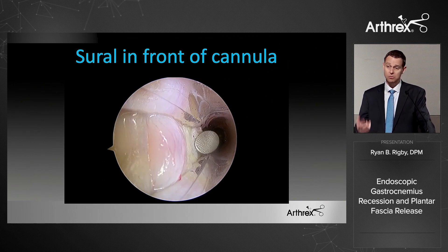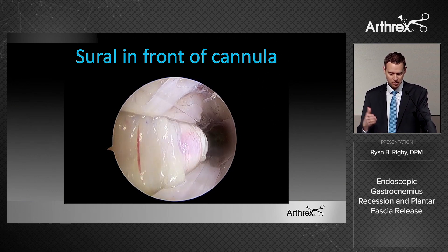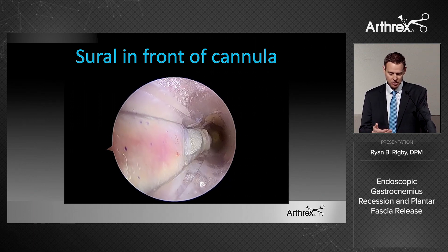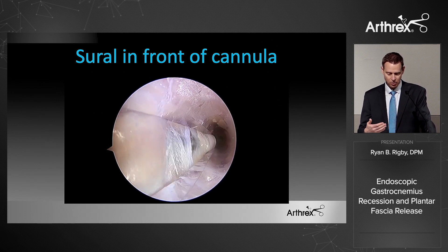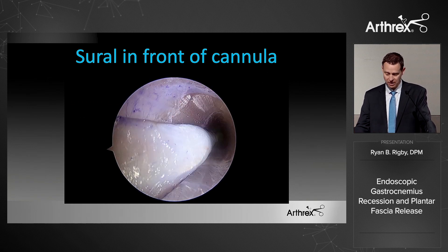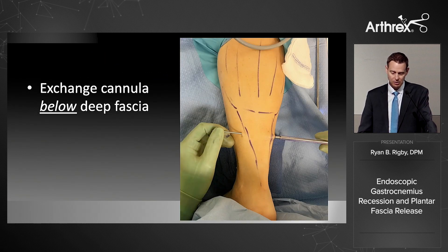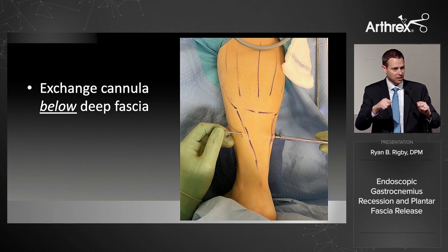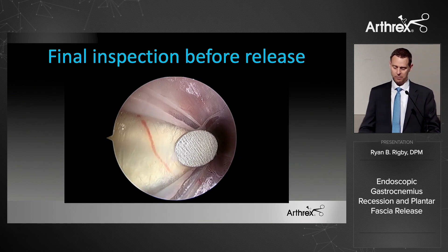If the sural nerve is sitting in front of the cannula, you have two options: pull out and go open, or use the dissector tool to gently work your way in front of it. You can see the beveled edge working across, establishing the plane under the deep fascia. I then pull out the cannula, take that switch stick, gently move it up and down to create a pocket, and put the cannula back in below the deep fascia and well away from the nerve.